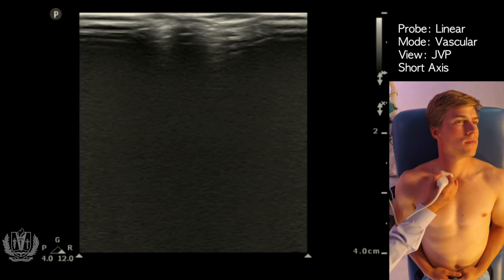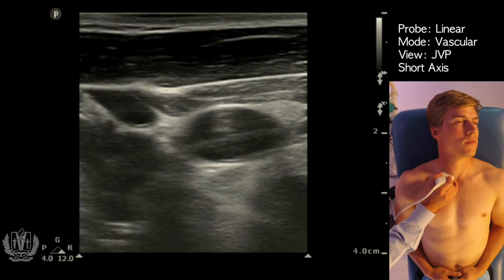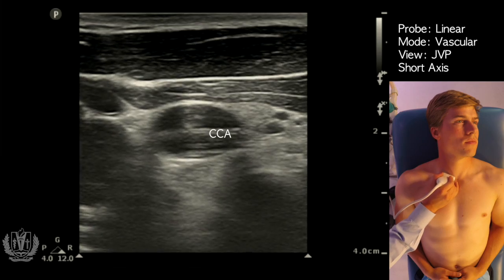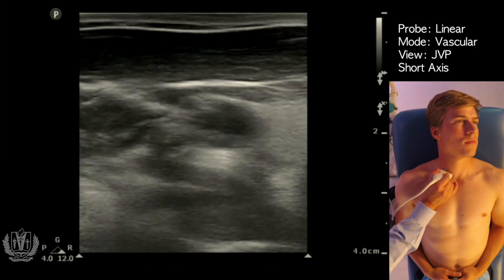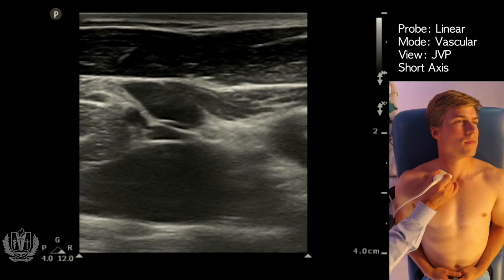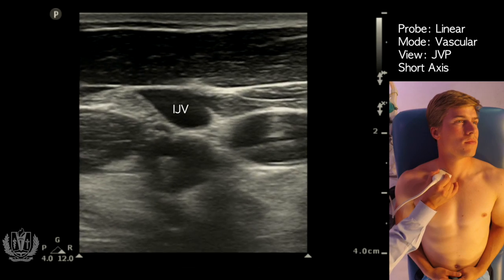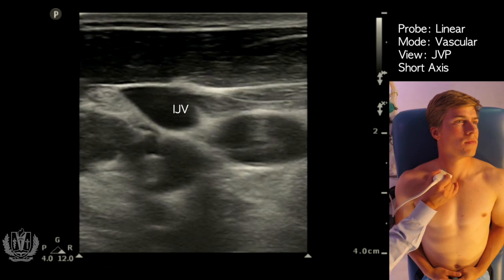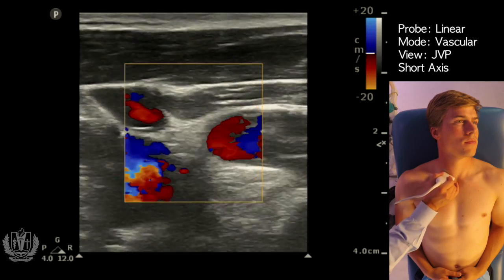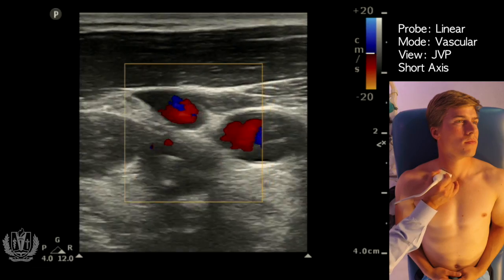We're going to place the probe right above the clavicle. The structure on the right side of the screen is the common carotid artery — you can see it's pulsating. The structure on the left side of the screen is the internal jugular vein, which is a lot more collapsible and has more of a venous flow pattern. With color flow, you can see the flow in both the artery and the vein.